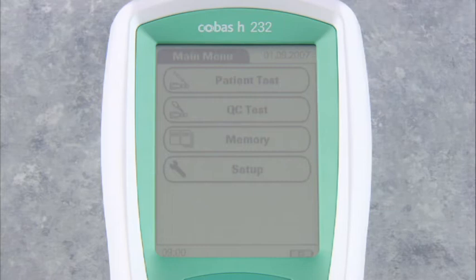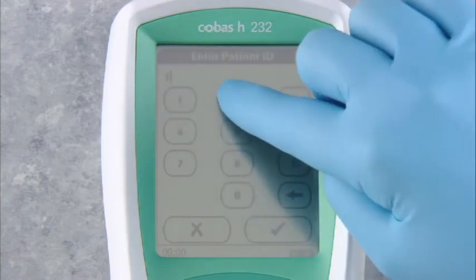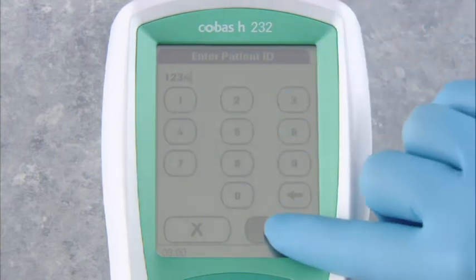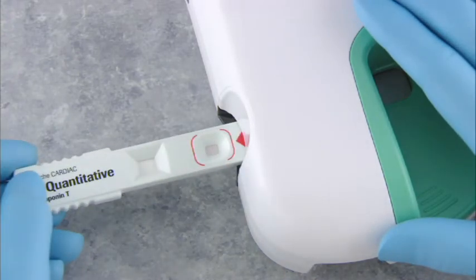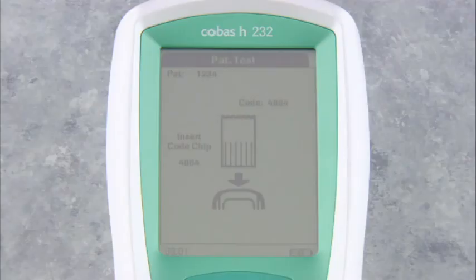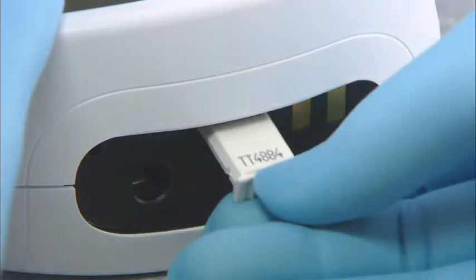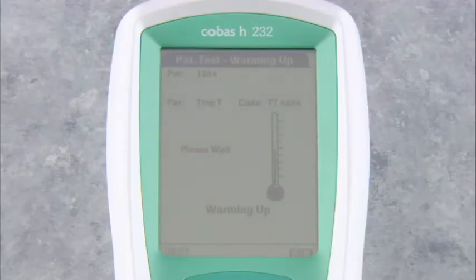At the main menu, touch the patient test screen prompt. The display changes to enter patient ID. Using the numeric prompts on the touch screen, enter the patient ID, then touch the check prompt. The screen shows patient test — insert strip. Insert the Roche cardiac test strip into the test strip guide so that the application area faces up, in a smooth even motion. If you have not run a patient test with this lot of strips, the screen will request that you insert the appropriate code chip. Insert the code chip into the code chip slot. Once the code chip's information has been read, the screen will continue by warming up the test strip as indicated by the thermometer icon.